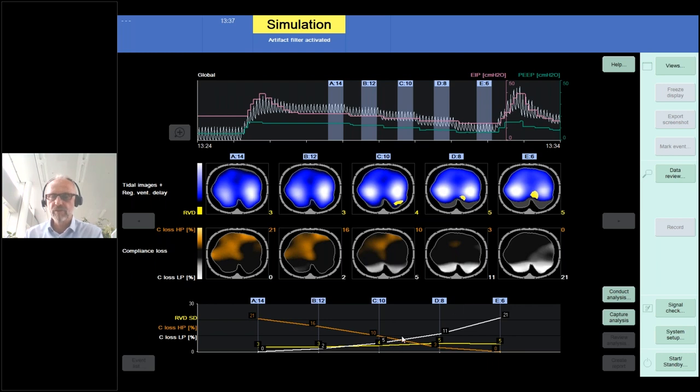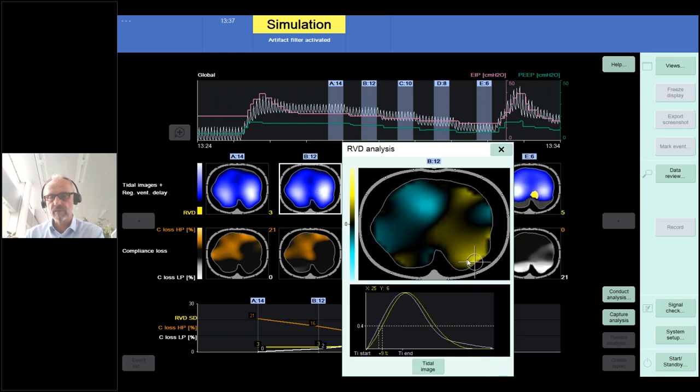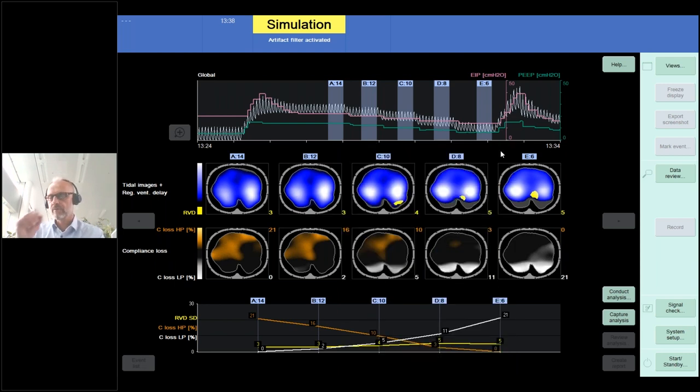And then, suggesting here the crossing mark, somebody would probably set the PEEP to 10. However, if you see those yellow spots, you could do an analysis of those. And if you see, oh, there's a very late opening that disappears at the next higher PEEP level, you could either decide for the next higher PEEP level of 12, where, when you take a look at those images, you still see a very slight delay, but no matter where you go here, it looks much more homogeneous as compared to the PEEP level of 8. Or you could probably also try to increase the respiratory rate so that the lung doesn't have so much time to fall into this pattern of cycling, opening and closing.